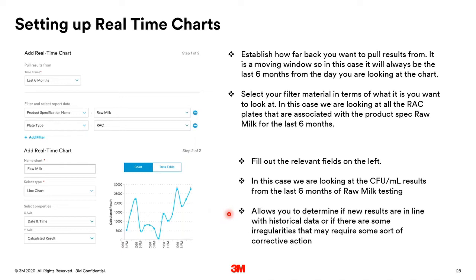So this is also part of the artificial intelligence of this machine, being able to actually get results from 6 months together within easy clicks.